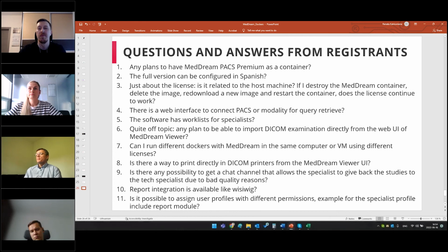This will be announced in 3 weeks, and you will be able to connect with our support team and work. It will just not be supported for all PACS systems. Several systems will be supported, so you need to communicate with your setup to know whether your system will be covered.